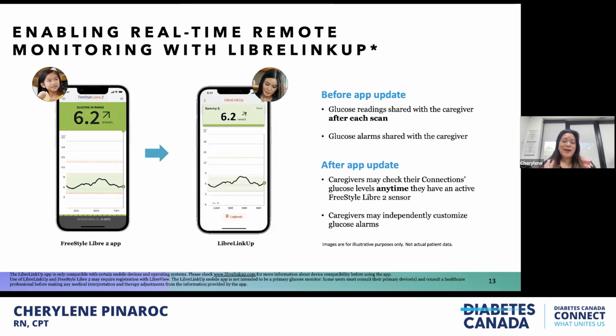And before the app update, I know it was annoying. A lot of patients would call me and say, oh, my caregiver or my loved one hates all the alarms, because anytime there was an alarm on before the update, they would get the alarms too, and then they would only have the shared alarms. After the update, now the caregivers can actually change these and customize their glucose alarms so they're not getting so many alarms at the same time.